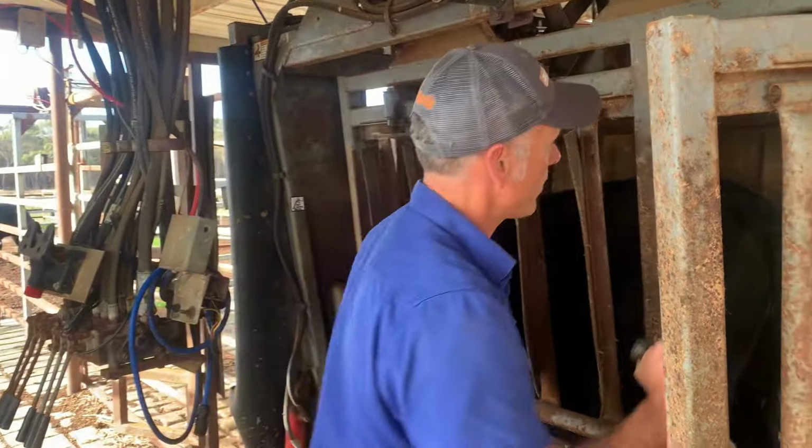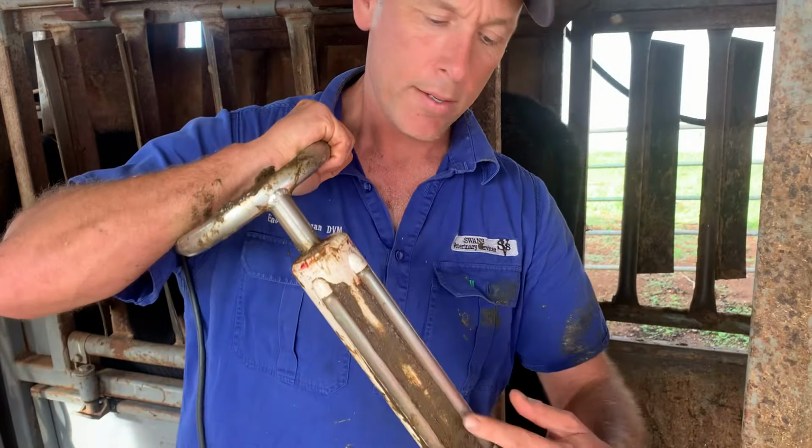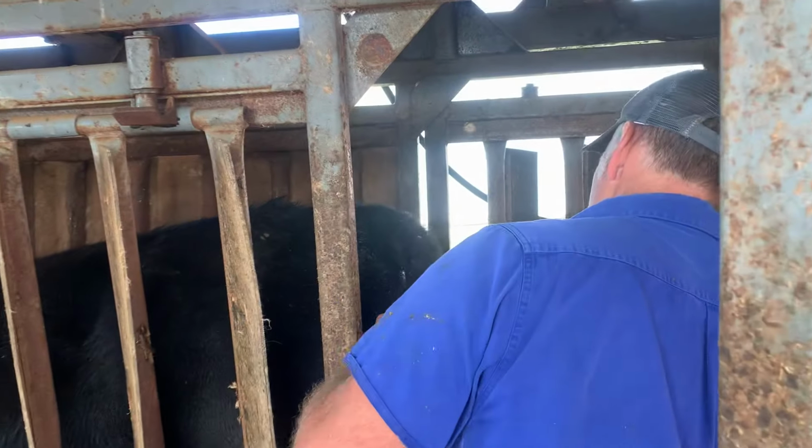What John's trying to do is grab a bunch of yearling bulls. We'll find the ones that can work, and then they'll be used over heifers. You grab, and then slide this probe in. The probe's got two little electrodes here. Slide that in.